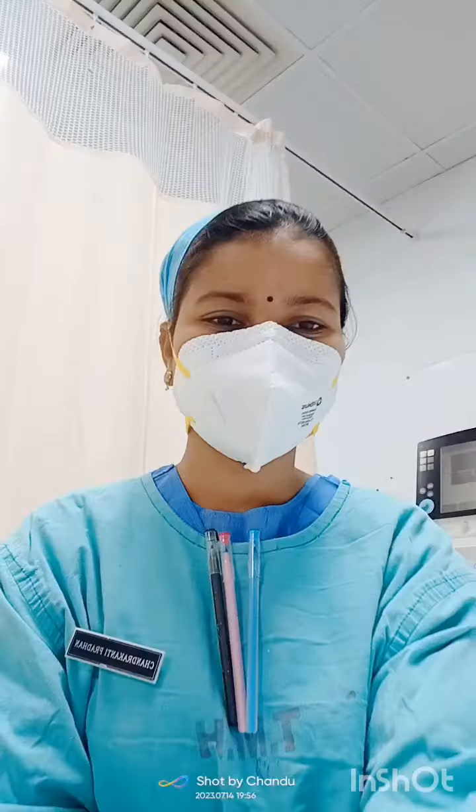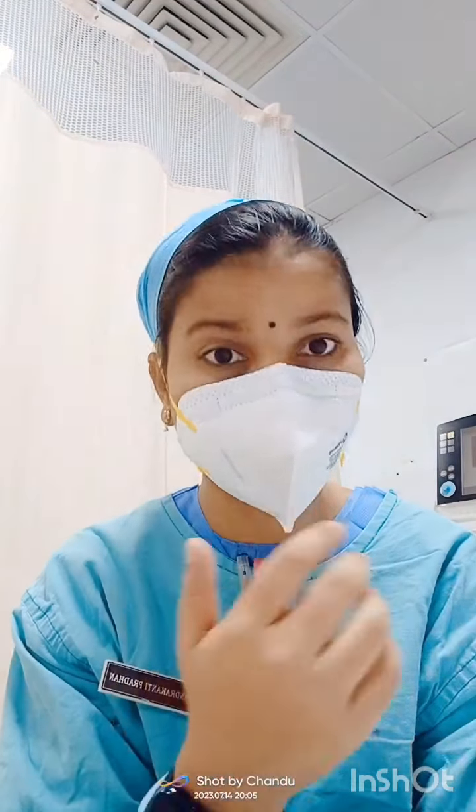Let's come to the important thing, the procedure of defibrillation or cardioversion. Before doing any procedure, we should take consent from the patient or the family member, which is done by the assigned doctor. After consent is taken, you have to give some minor sedation or anesthesia to the patient, because it's a painful procedure. The examples are morphine, midazolam, and fentanyl.